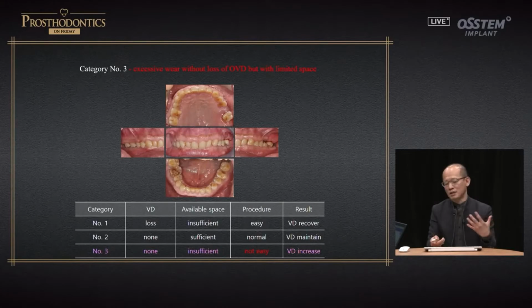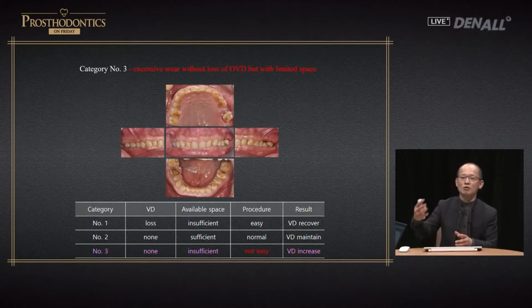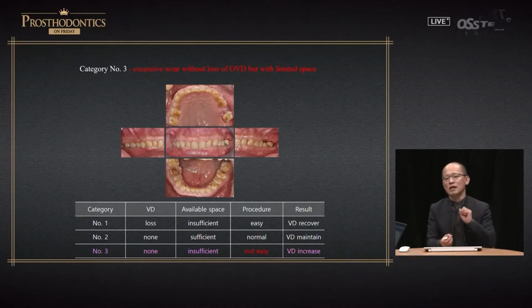On the articulator, you make an evaluation and make a decision. You also need a long-term temporization period. You have to monitor whether the patient becomes compliant, and with the lengthy temporization, it's going to be tricky.